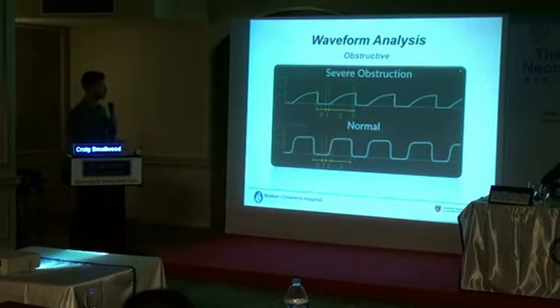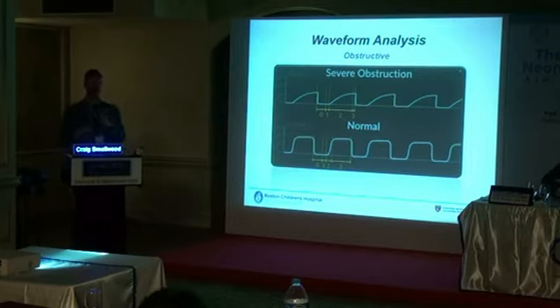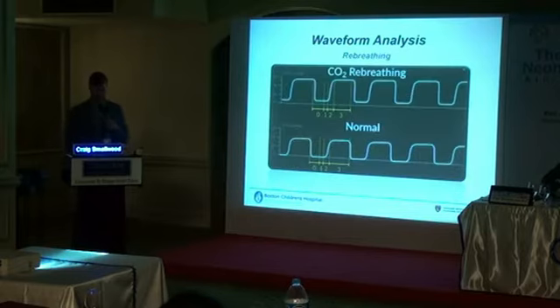Compared to the normal, you can see exactly what I just said. Basically, the lengths of each of these portions of the capnograph are really messed up. Phases 0 and 1, really no difference. But in phase 2, you can see we're spending the bulk of the time there. There's just not that much CO2 in that portion of the breath. That's why these patients with severe obstruction, whether it be bronchiolitis or asthma or mechanical obstruction, doesn't matter, can't ventilate well: they're not getting rid of their alveolar gas.